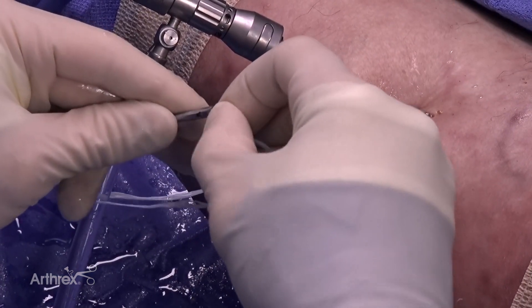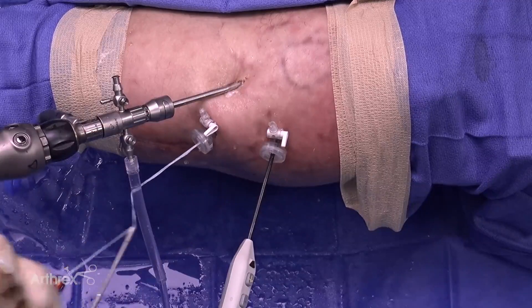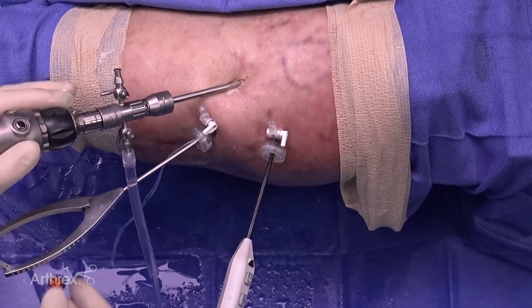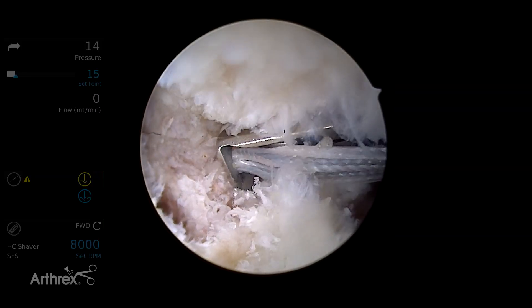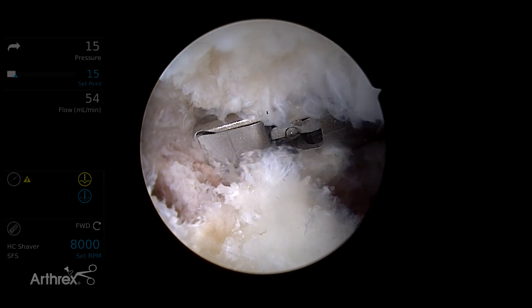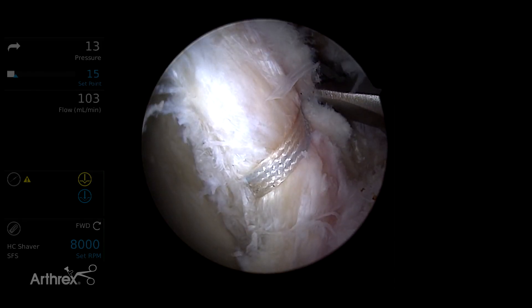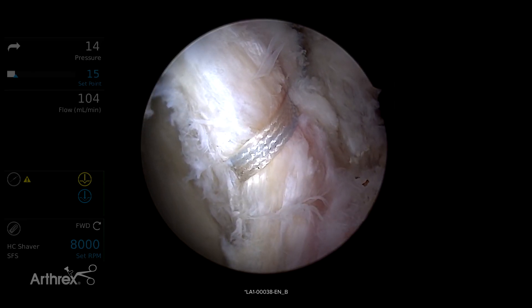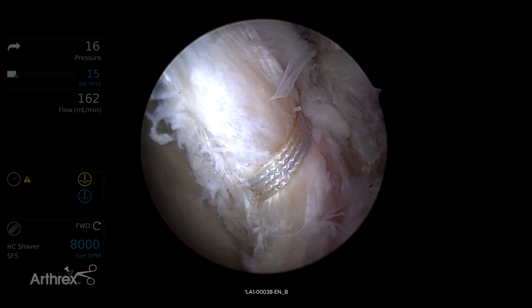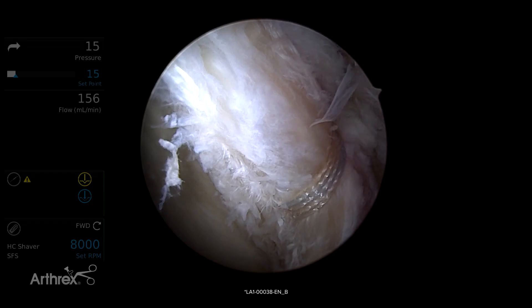The next step uses the new Arthrex Suture Tape Cutter. It loads as an end-loading system and then easily slides down the portal, cutting perfectly as an end cut. We pull on the sutures slightly — gentle suture pressure allows ease of cutting at the level of the anchor. The first stitch is then placed. I prefer suture tape over fiber wire because it broadens the pressure on the labrum and minimizes potential labral cut-through if a patient has a traumatic event.